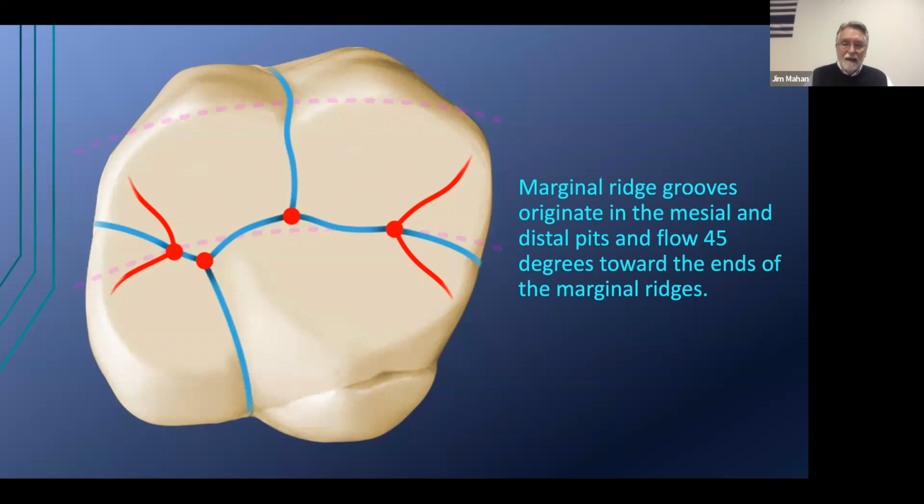We've used a guideline for everything, and we're using angles and positions of the pits just slightly off of the central groove. Now, when I say slightly off of the central groove, how far off? Well, how big is the tooth? This is a big tooth. The center of that is probably 3.5, 4 millimeters away. If your tooth is 1/10 the size, you could see what that would be. So the concept here is it does not touch the line.